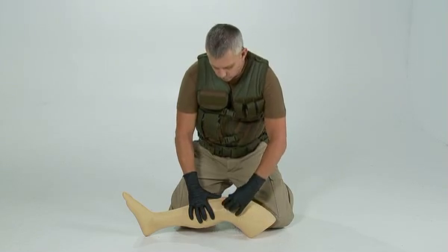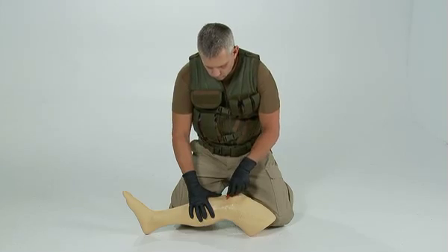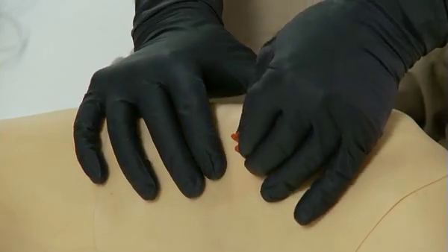To remove the cannula from the bone, use the square notch in the red safety latch by placing it around the cannula hub. Pinch the combination between your fingers and pull straight up. Some twisting may be required.